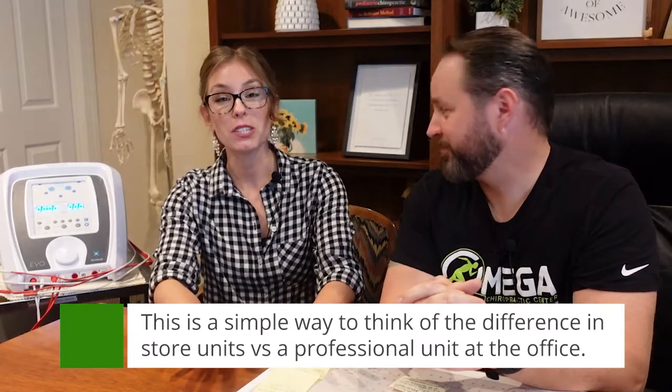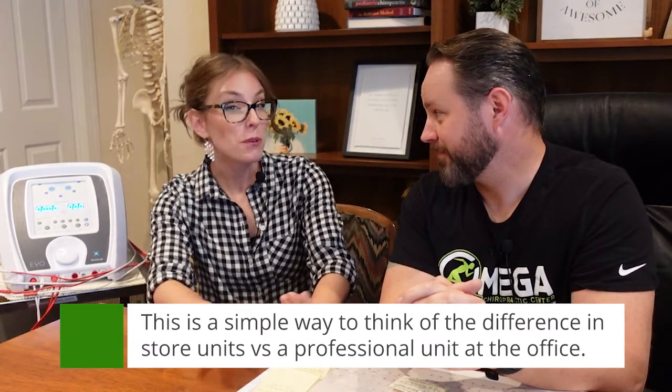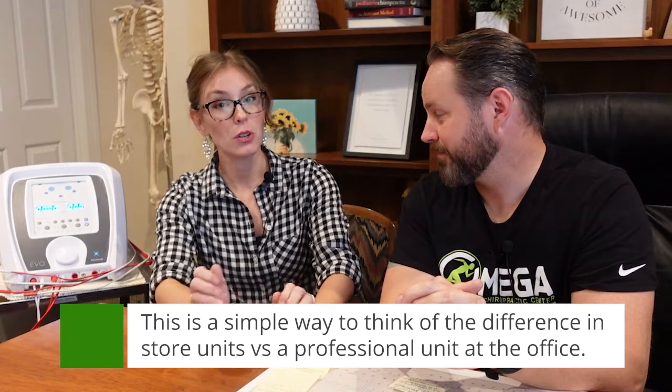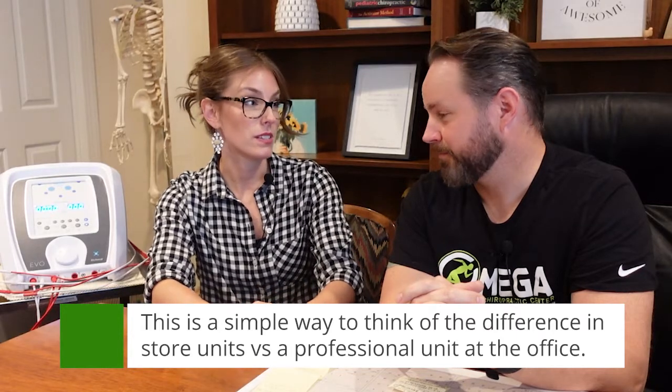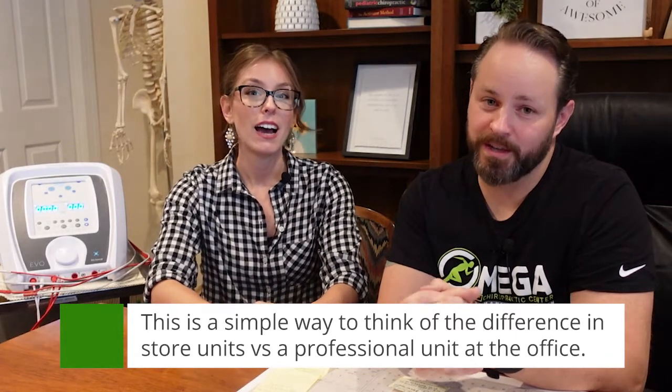All of those words are just mind-boggling. So we're gonna get into a little neurology segment. You gotta understand why you're doing this. What's the validity of me doing this versus my TENS? What I say to patients is a TENS unit is more superficial and muscle stim is able to go deeper and create more of that healing and decrease the spasms. You're not watching this podcast to just get the very superficial TENS unit aspect. So we're down the rabbit hole.